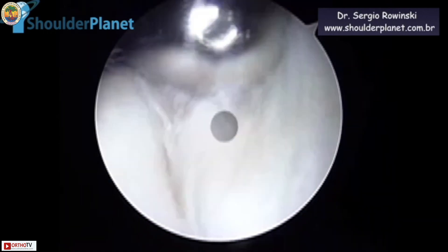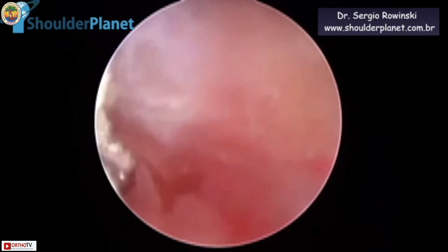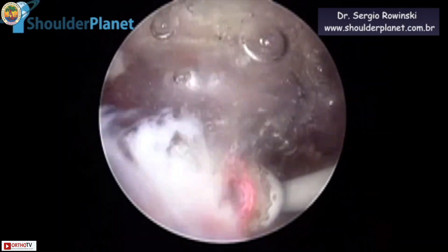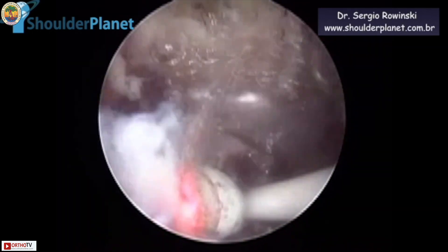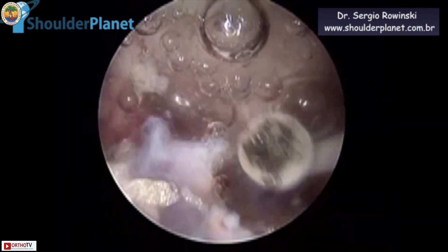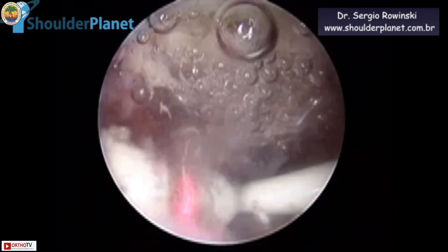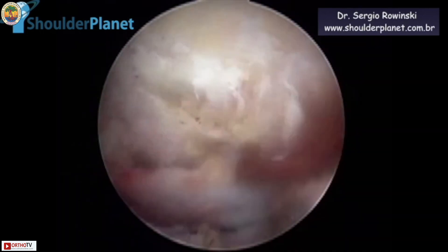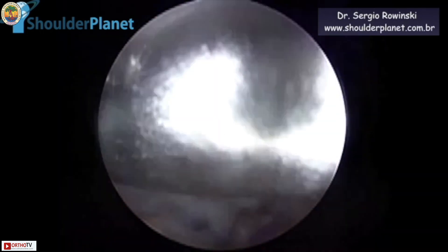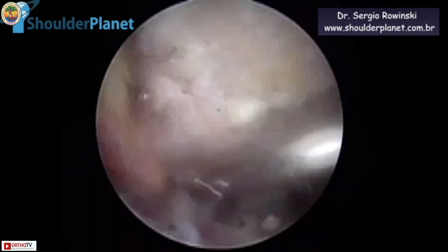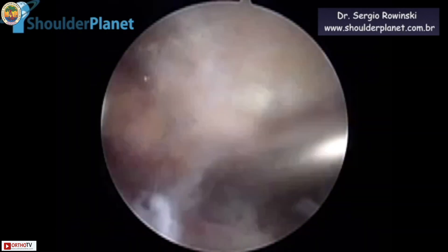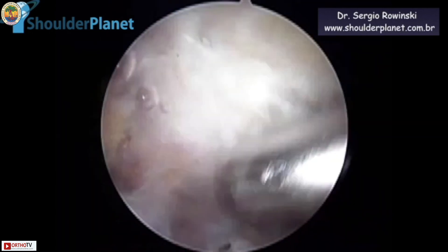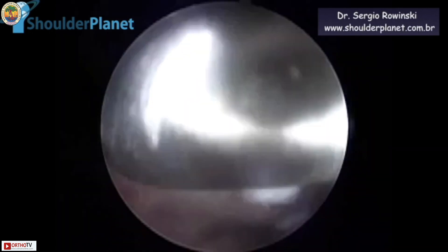After that debridement, we moved to the subacromial space. Now we are in the subacromial space working through the lateral portal, watching through the posterior portal. There was a lot of bursitis and synovitis that we had to remove. We are now starting to detach the coracoacromial ligament from its acromial insertion. Once the coracoacromial ligament was detached from its acromial insertion, this is what is happening now.